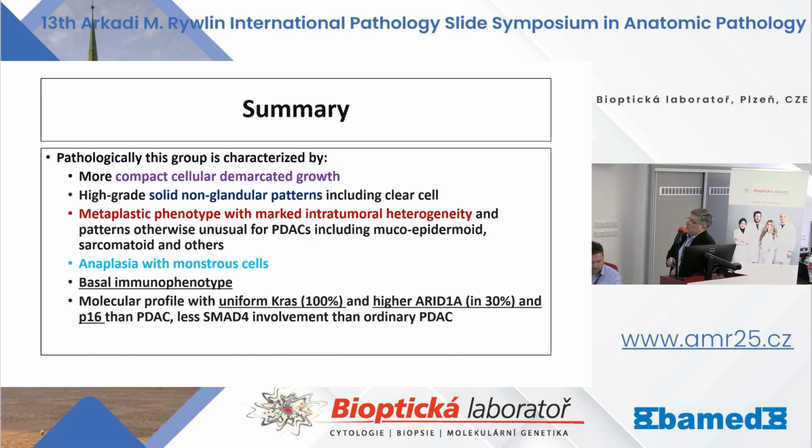I tried to illustrate the histologic and immunohistochemical phenotype of this group and the importance of ARID1A, which may be important in the future in terms of the management of these patients. So I wanted to show you a subset of pancreas cancer that seems to be quite different than our ordinary pancreas cancers. We're still studying these, we're trying to understand what they're about, so if you see cases like this, please share them with us and let's discuss. Thank you very much.